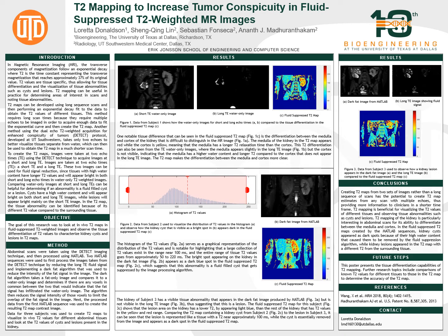The benefits of T2 mapping are that it provides us with more information and can help to visualize tissue abnormalities. Usually, T2 maps are obtained by long scanning sequences, so that enough echoes are obtained to create an exponential curve fit. The method using detect images needs only 2 echoes, which means that possibly any scanner taking multiple echoes would be capable of creating a T2 map estimate that can give more information to clinicians.